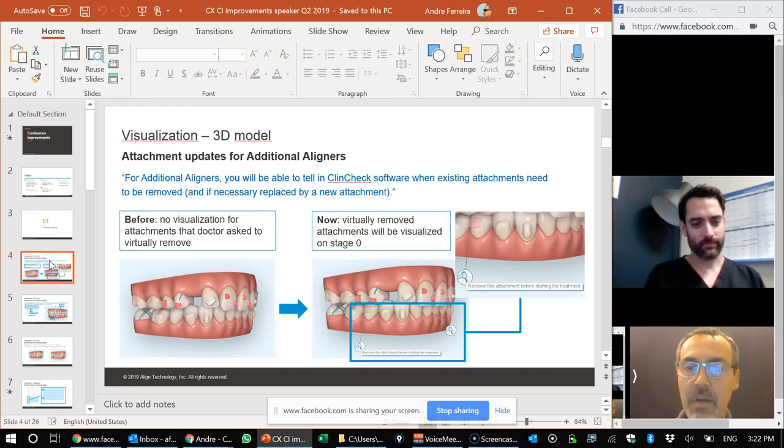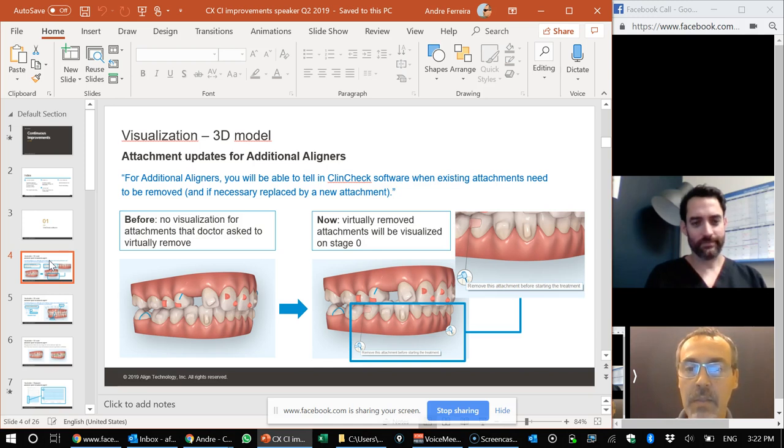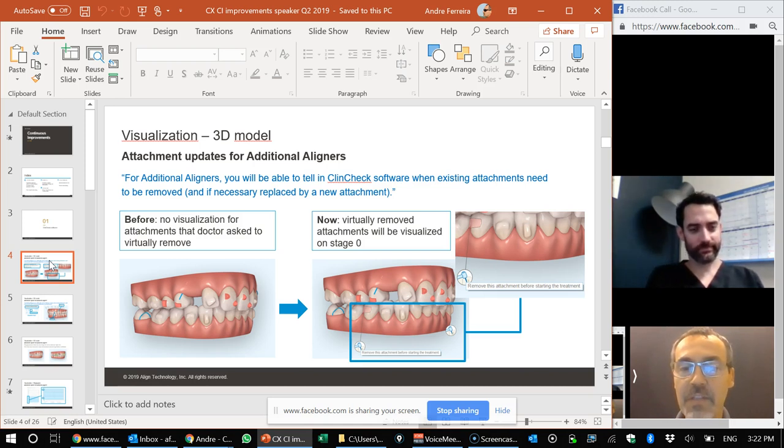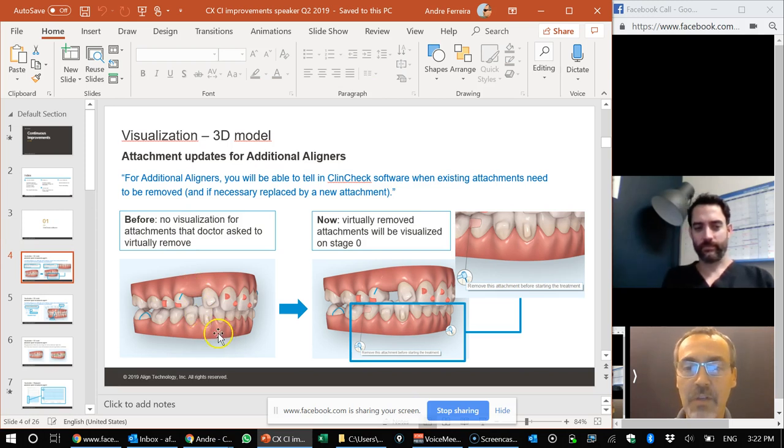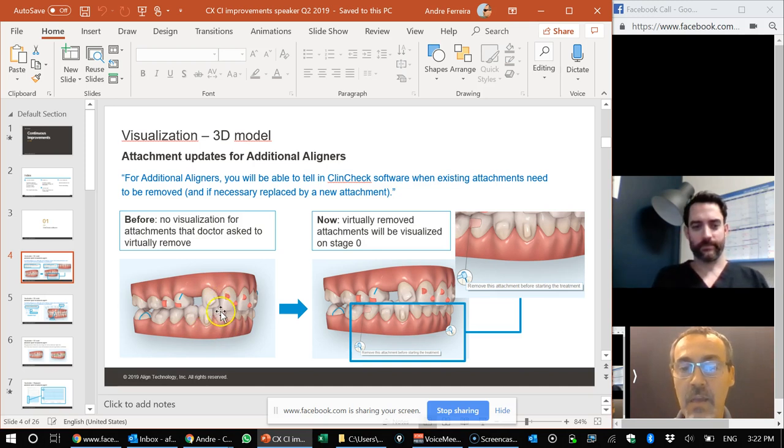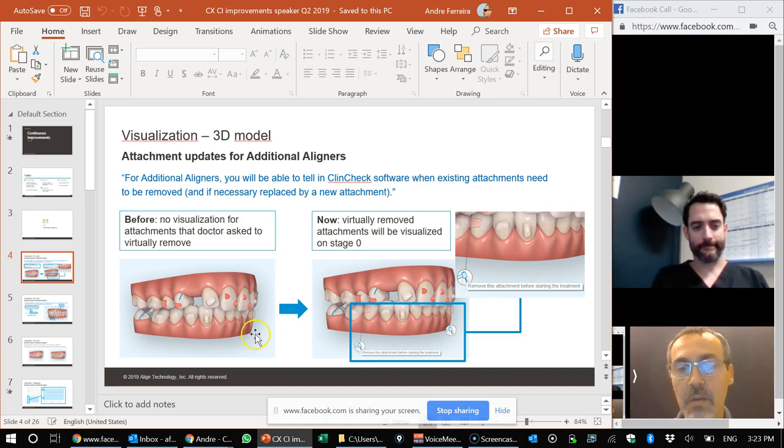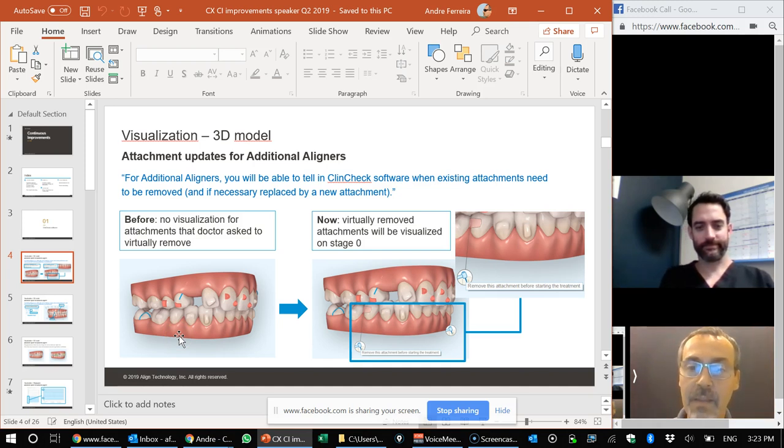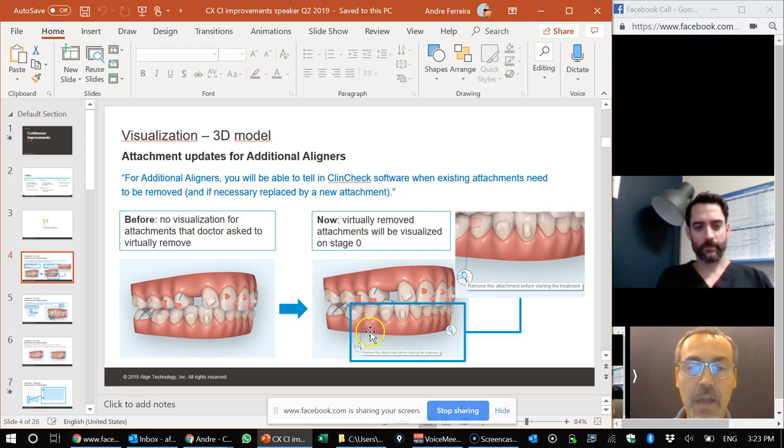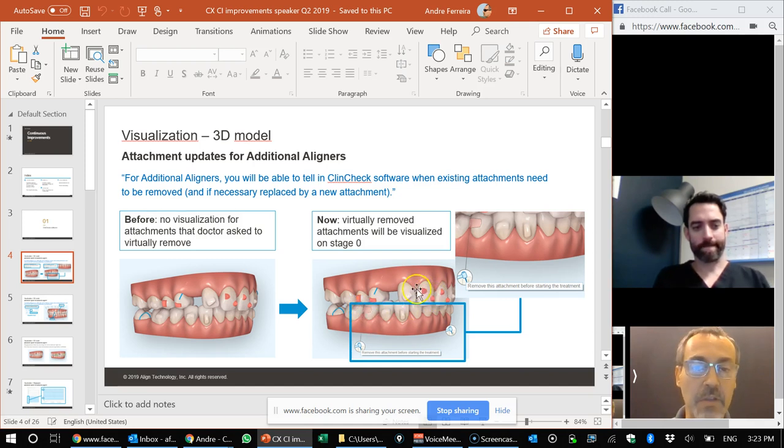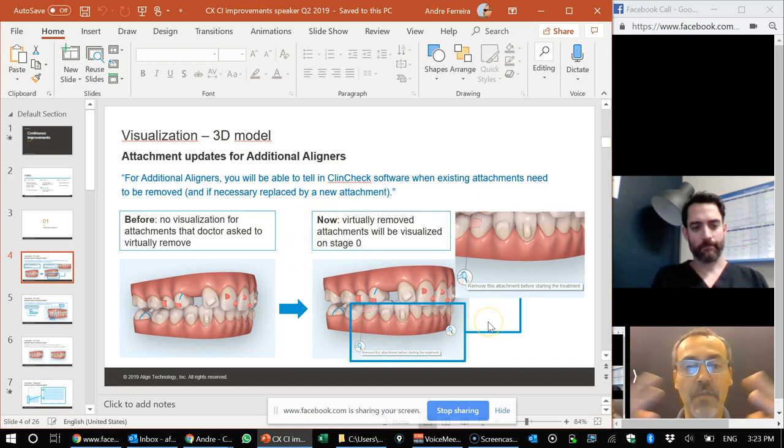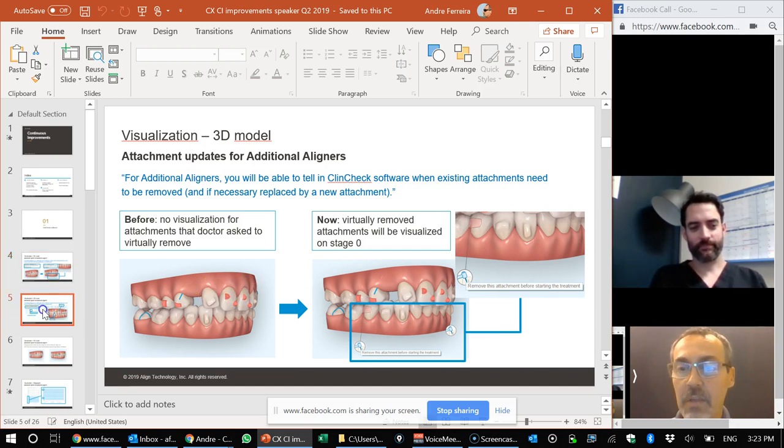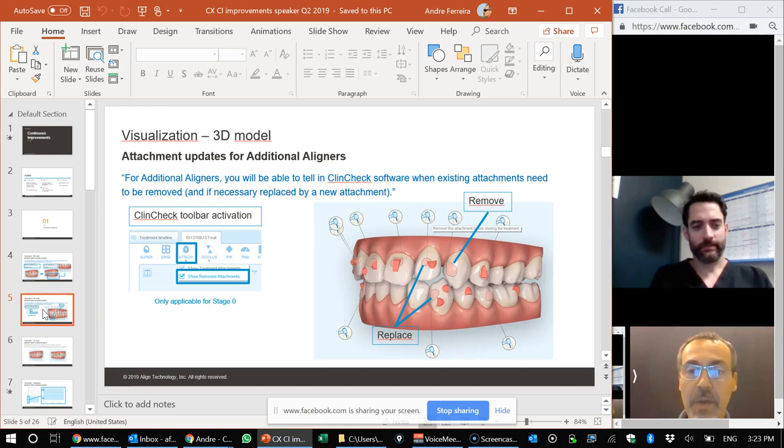I'll take this first slide here. It really relates to how the software now displays removing or existing attachments. So if we scan with existing attachments, and we have come to the conclusion that oftentimes it is quite possible to scan with existing conventional attachments and all the optimized attachments should be removed. So when you start doing that, you get a template with a whole bunch of attachments and the staff may be wondering which ones need to come out. So the new software now indicates with a hand piece the attachments that need to be removed. And there is a little ghost image of that. And obviously the new attachments are in solid color.